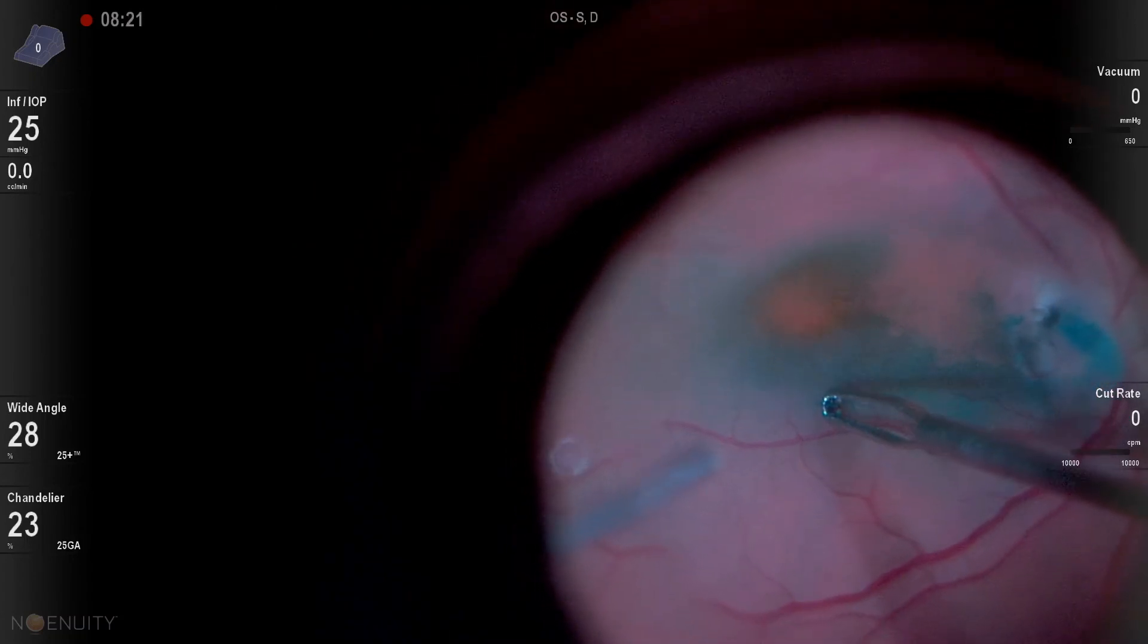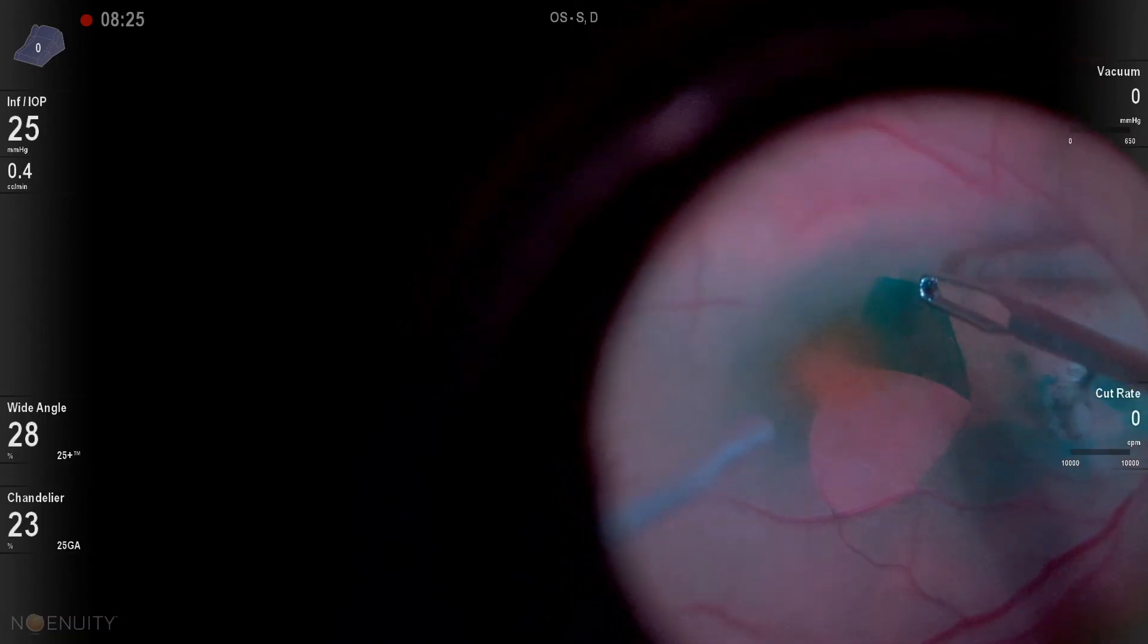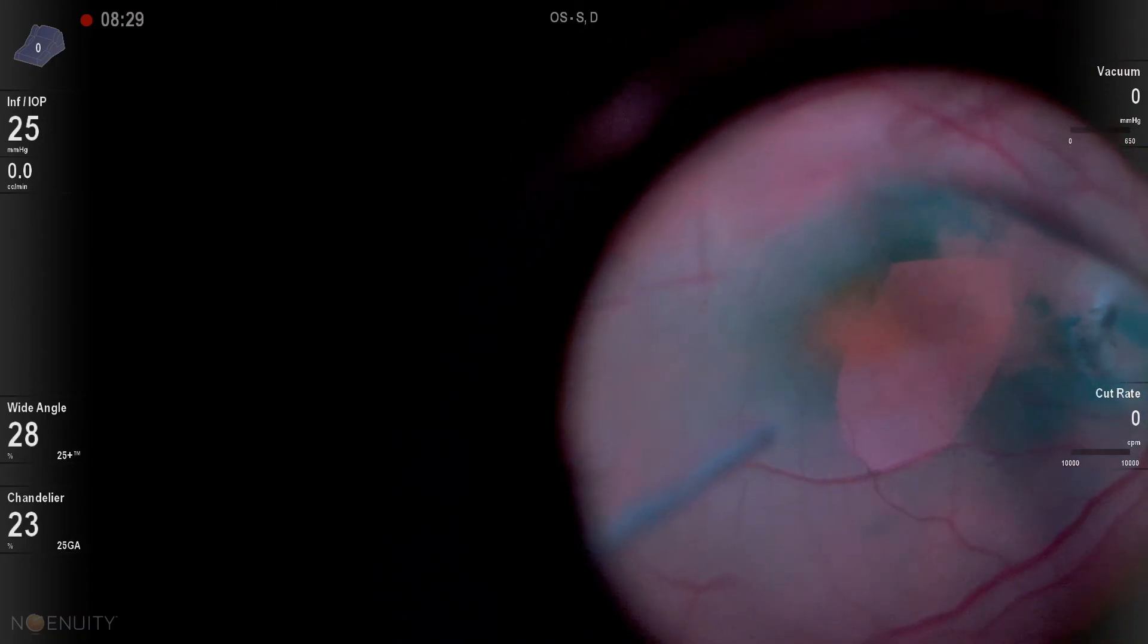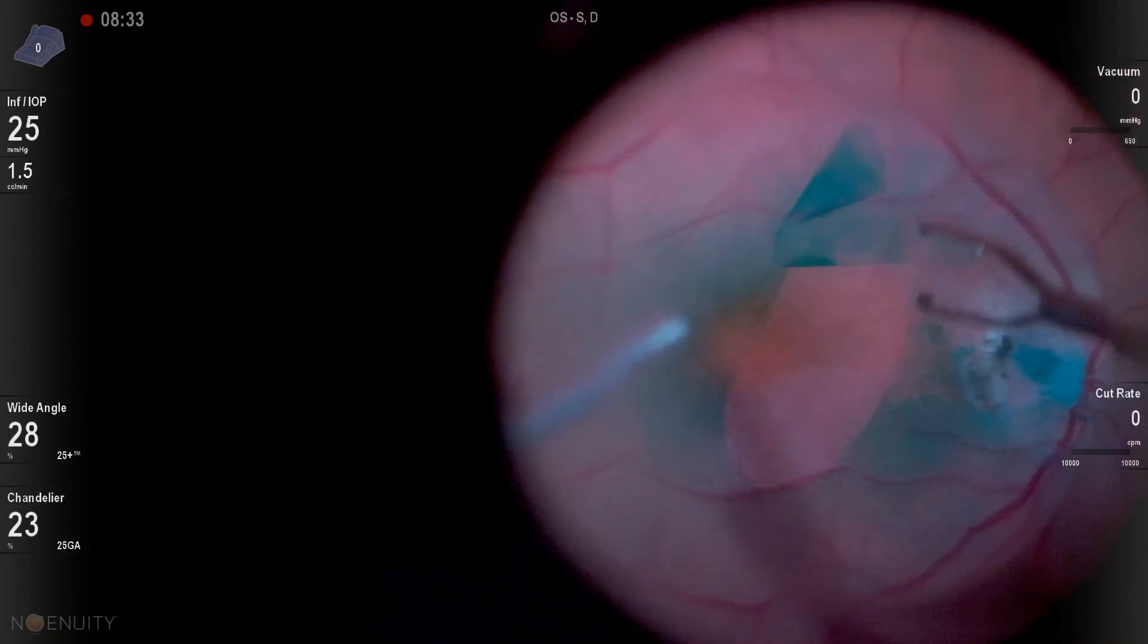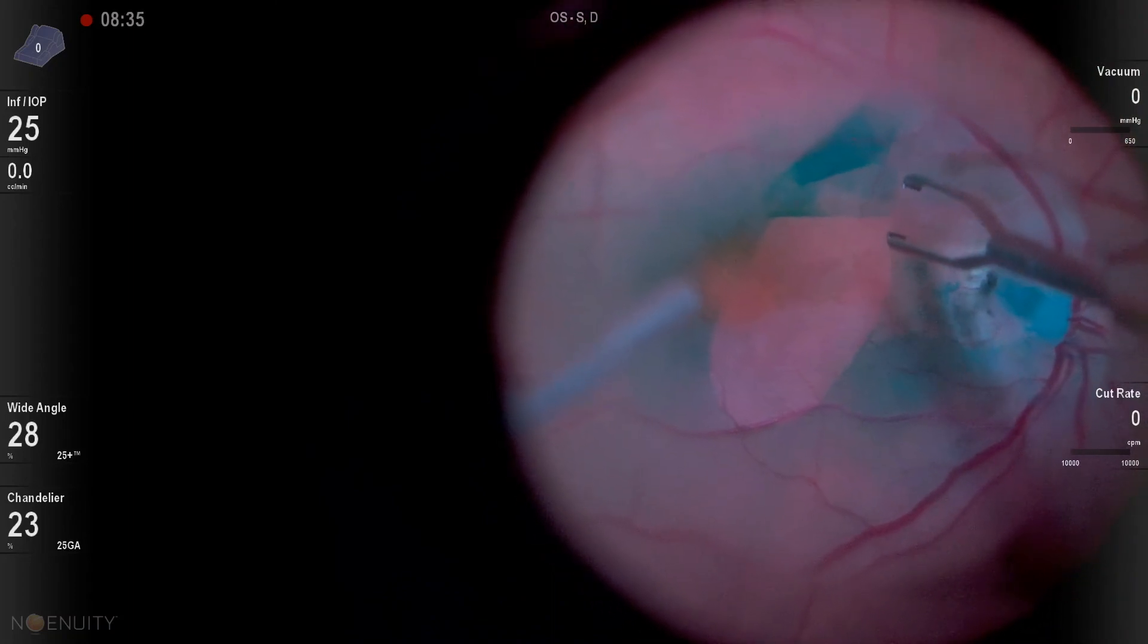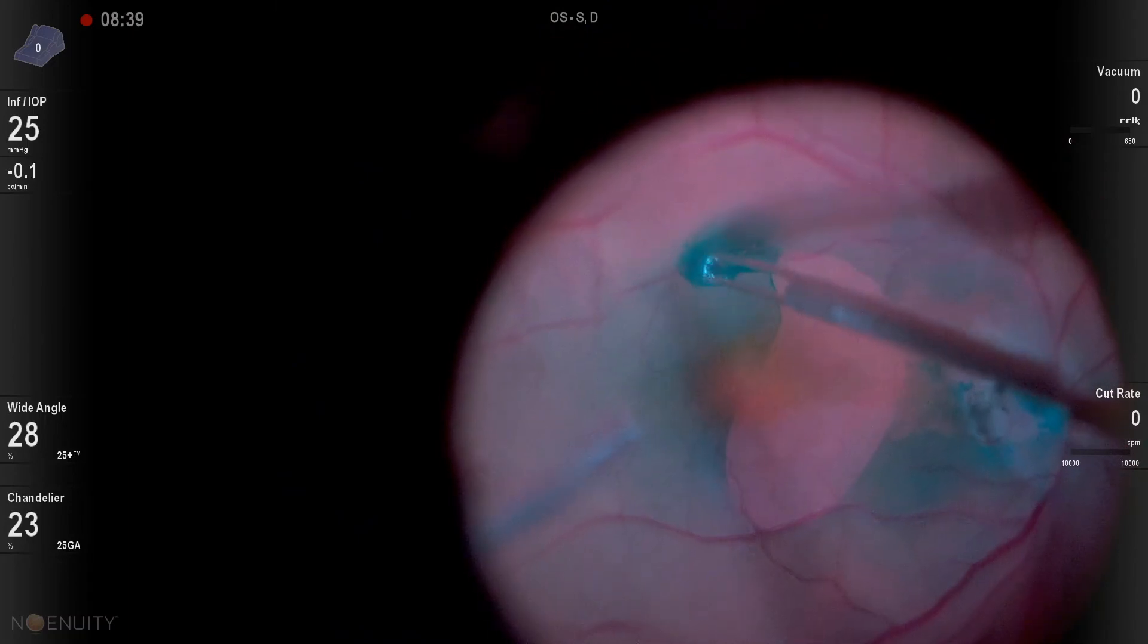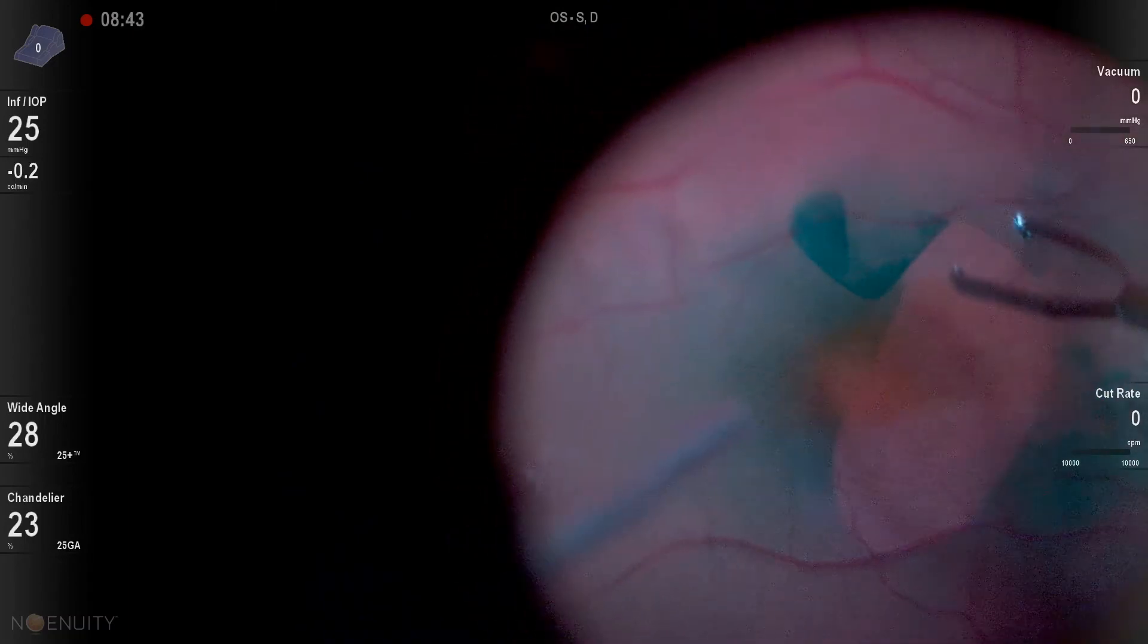So I went ahead and did my standard pinch and peel of the ILM. Here you can see peeling the ILM up and across. Interesting how the ILM really stained anomalously in the area of the fluid. You could actually see where the fluid had been or was by the fact that the ILM didn't stain as well in that area, which is very strange.